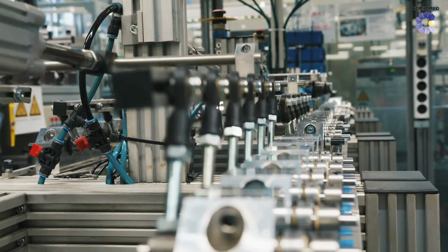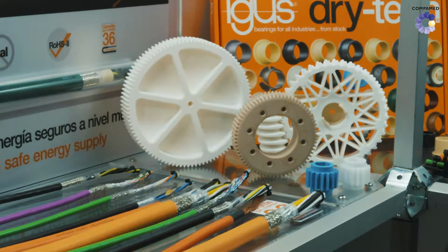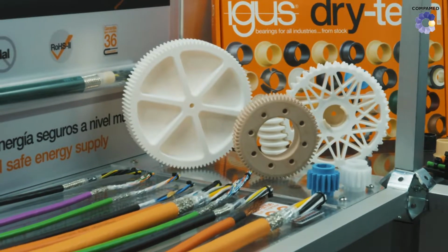Laser sintering is the most commonly used method in medical technology because it provides greater resistance, achieves a higher accuracy of components, and the component cost is lower since the laser moves about 100 times faster than the print head in the FDM technique. After their production is completed, medical devices are used in various fields.